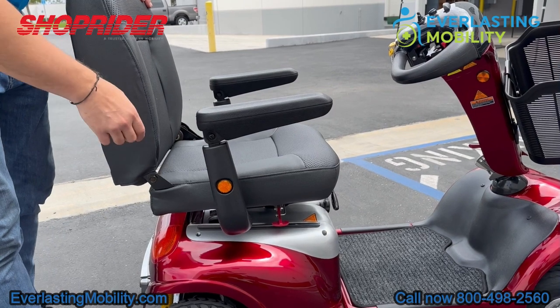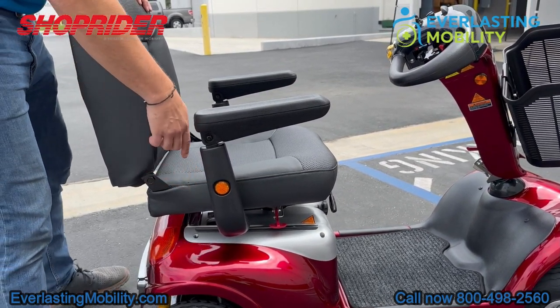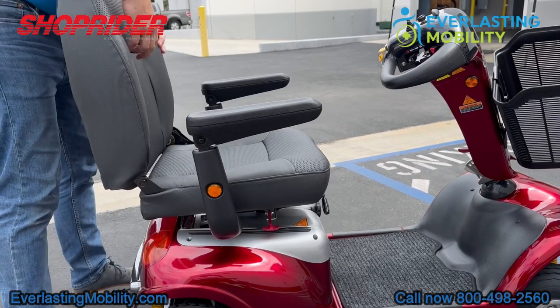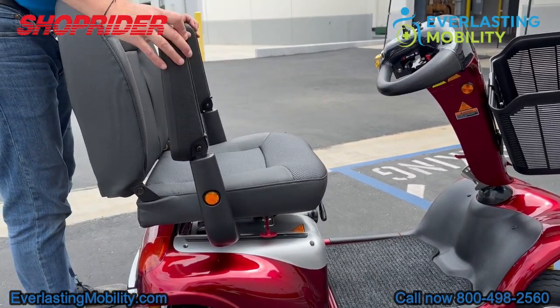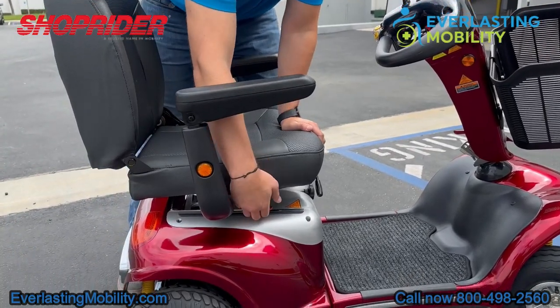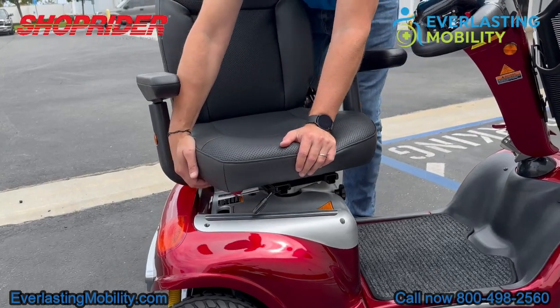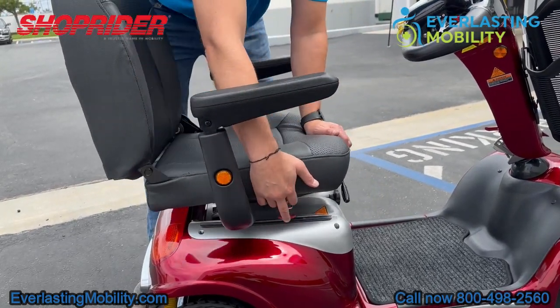On the armrests of the Enduro, there are two reflectors that add more visibility in the evening, located right on the armrests. The armrests also flip up, which makes it easier to get in and out of the chair. Plus the seat also swivels 360 degrees, which is another feature that makes it easy to get in and out.